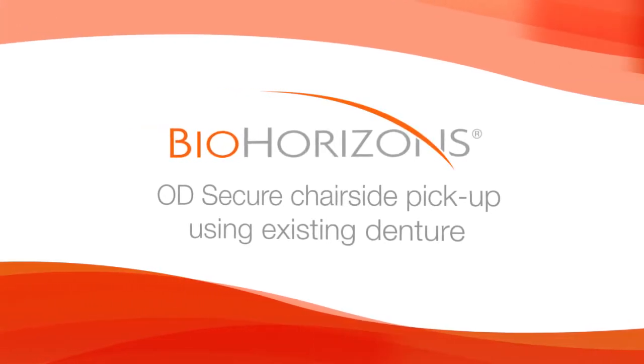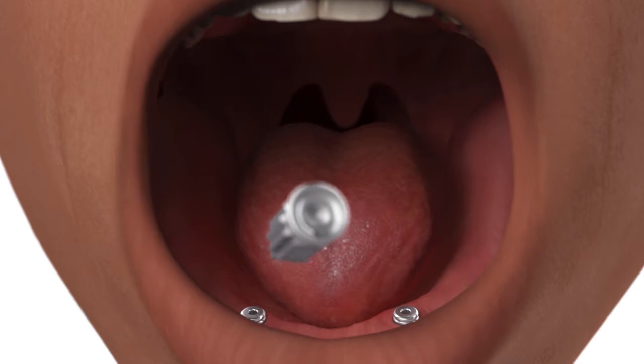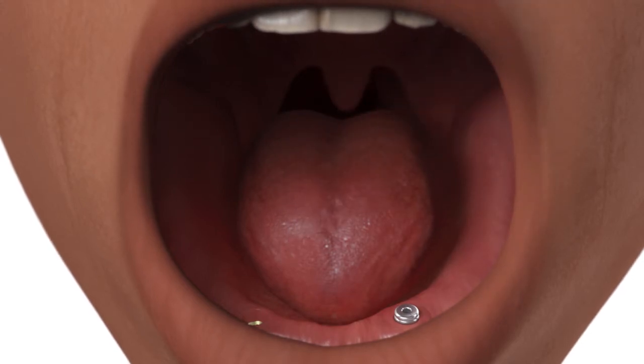OD Secure Chair Side Pickup. Remove the healing abutment and confirm that the prosthetic platform is free of any bone or soft tissue debris.